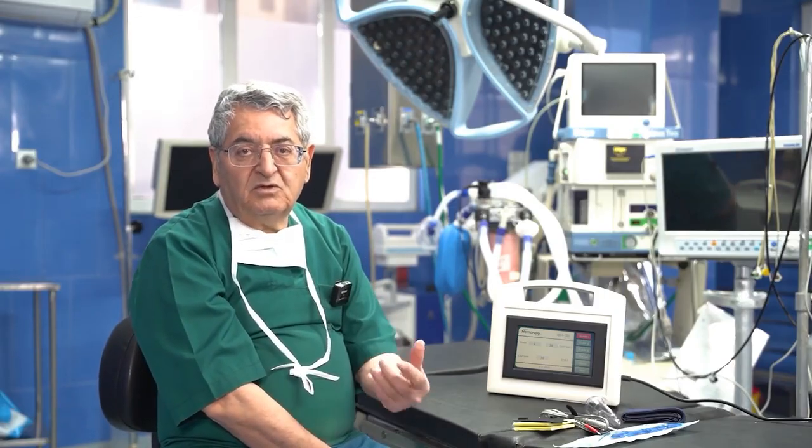We might even have to use this system or method once or twice to complete the treatment of the hemorrhoidal pile. But when we use the 30 milliampere setting and maintain a steady 30 milliampere current on the hemorrhoidal pile, the treatment time required is shorter. As I mentioned, for grade 1, it takes about 2.5 minutes. For grade 2, about 3 to 3.5 minutes. And for grade 3, about 3.5 to 4 minutes.